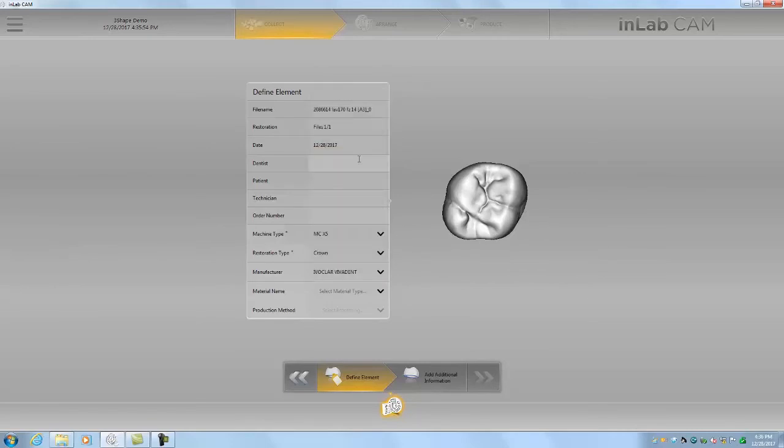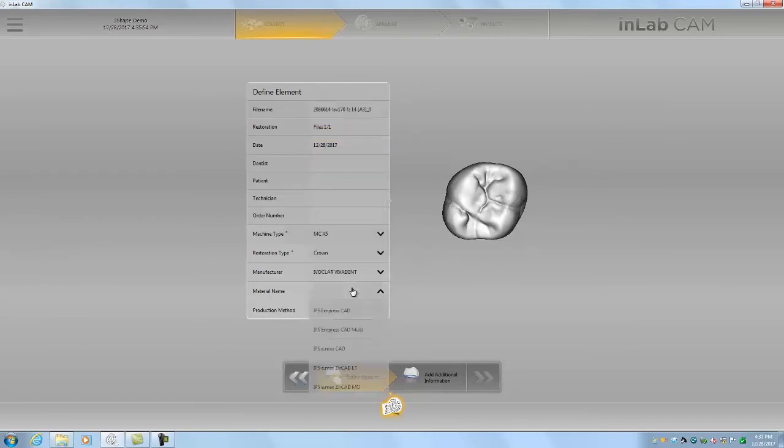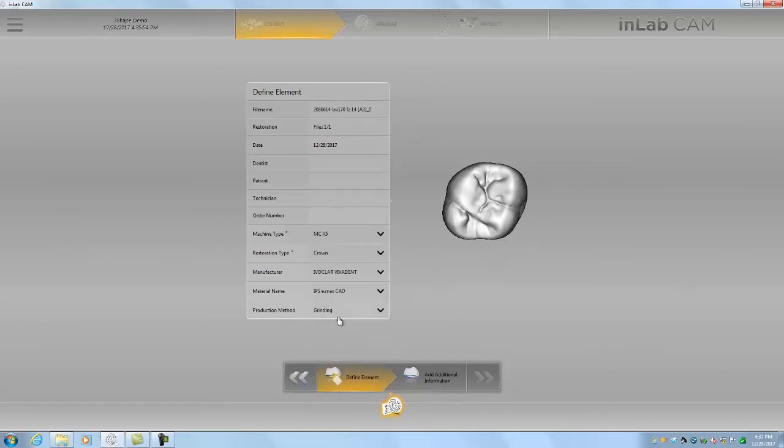So we might want to choose Ivoclar or Dentsply. I think Ivoclar. We'll choose the IPS Emacs CAD since we're going to be grinding out the blocks and we'll leave it as grinding production method.